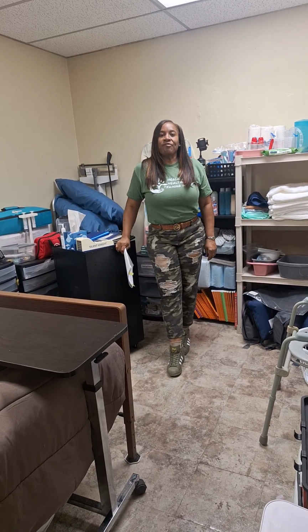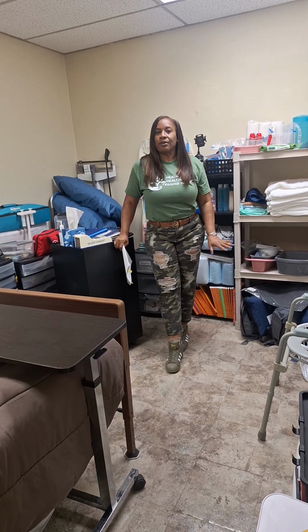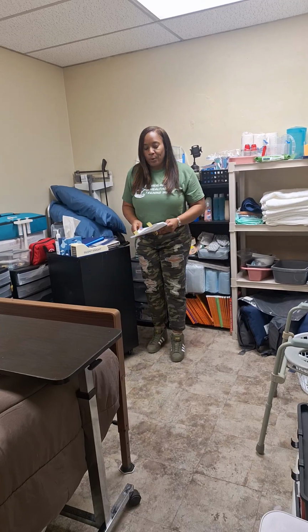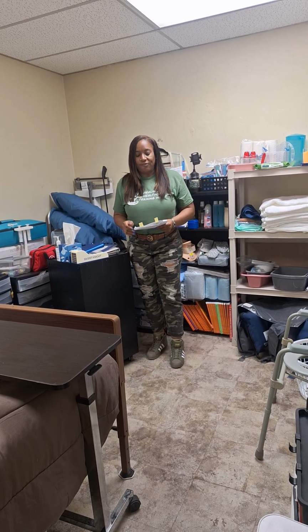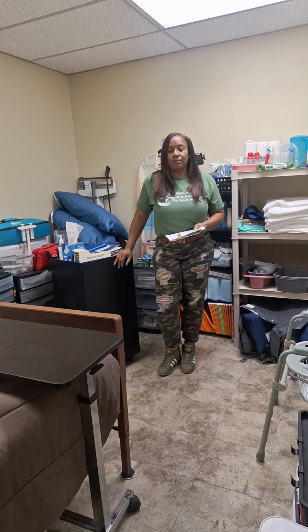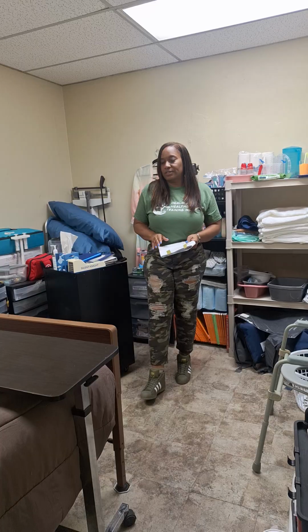I've done this video before, but I did it in two parts. I wanted to do it all together so you can get a feel of how it looks. I'm going to be doing catheter care for a female resident. This is one of your 17 testable skills that you have to do, and it may be one of the skills that you have to test on.